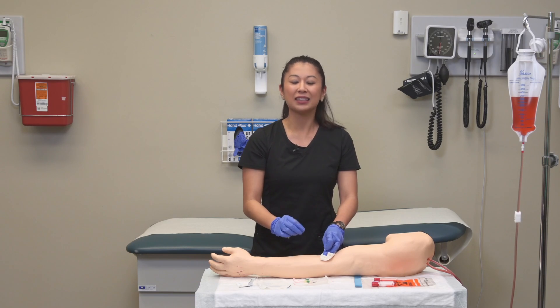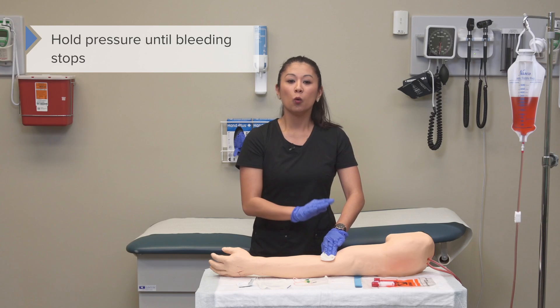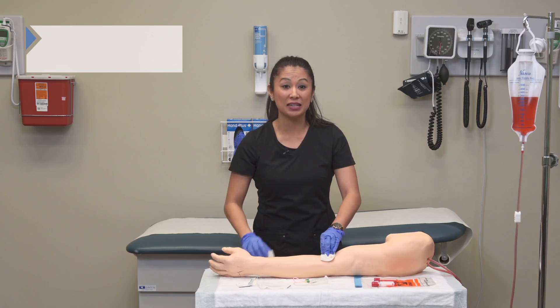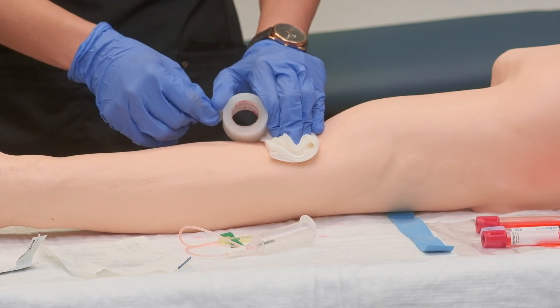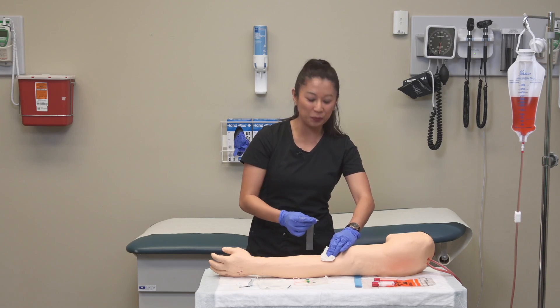Set the device aside and hold pressure on the insertion site. Once the bleeding stops, it's a good idea to go ahead and tape down the gauze. If your patient has another hand available, they can help you here as well.